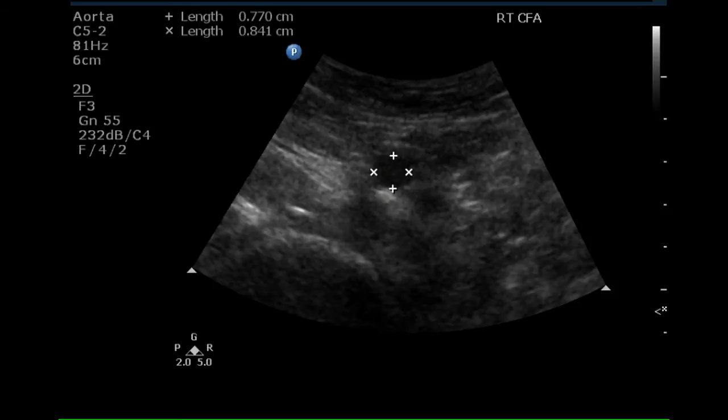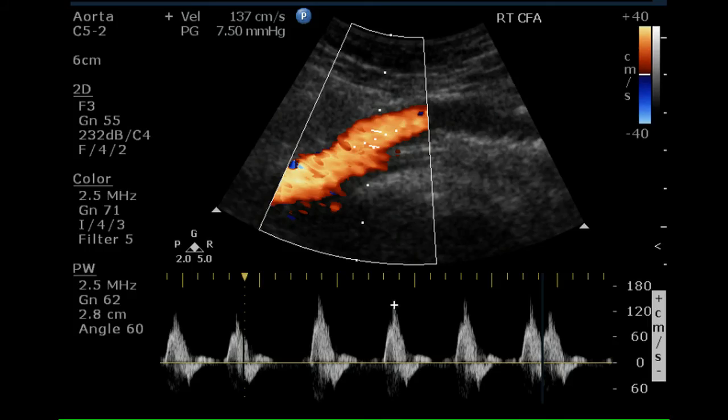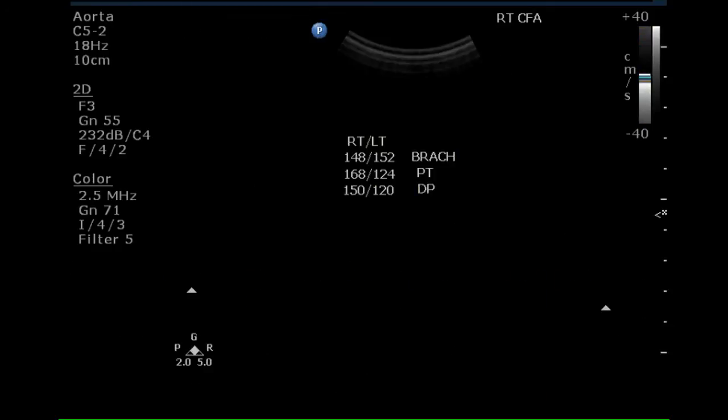The right common femoral artery is normal in size and fills completely with moving blood as demonstrated by the color Doppler portion of this image. The pulse Doppler waveform demonstrates a triphasic waveform.